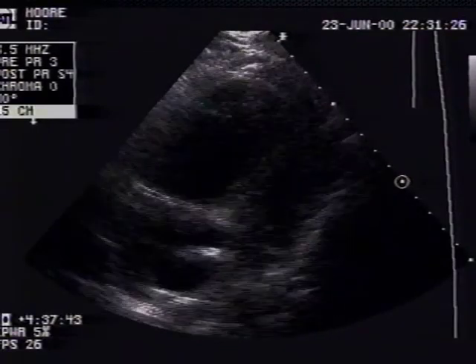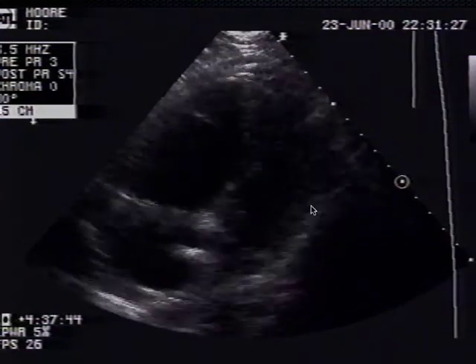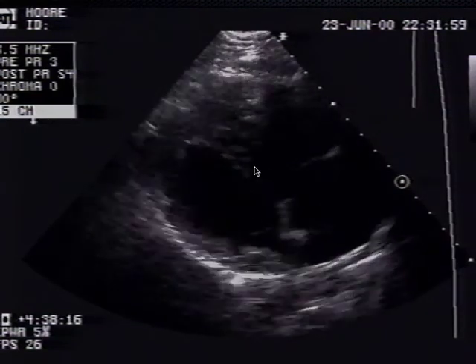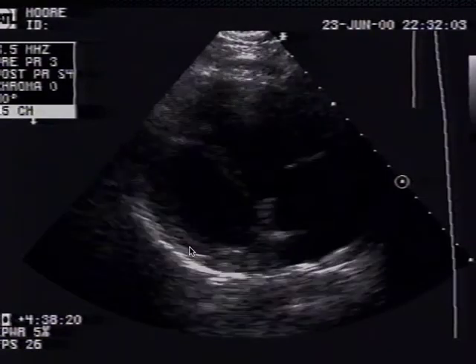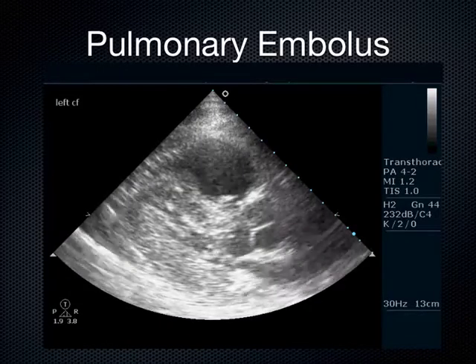This is another patient. This is not pretty, but it's an apical 4 chambered view. It's an old scan. This is the right ventricle. This is the left ventricle here. I'll let this play itself out for you. LV smaller than the RV. Here's the parasternal long axis, big RV, small LV, in this patient with basically pulmonary embolism.